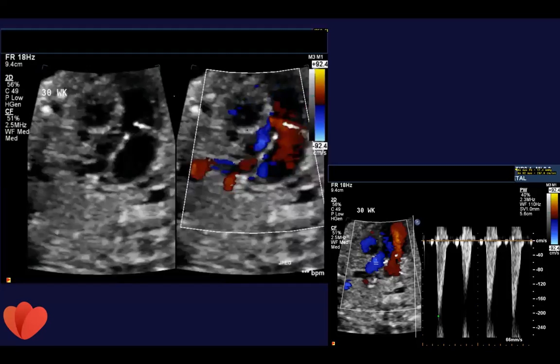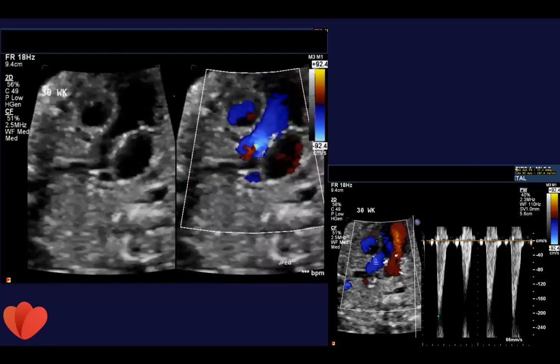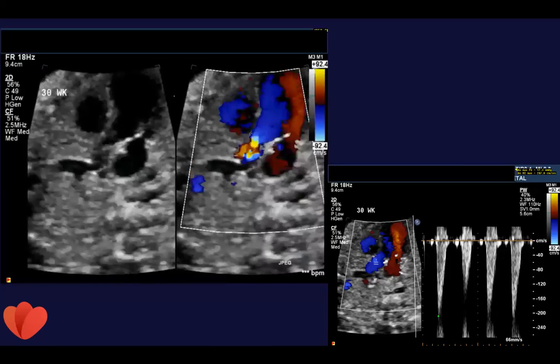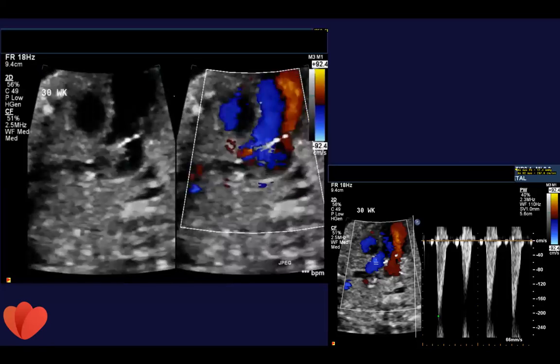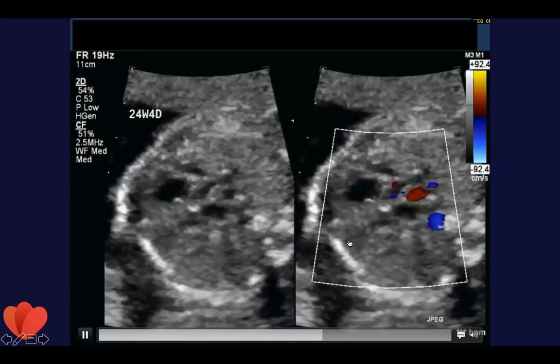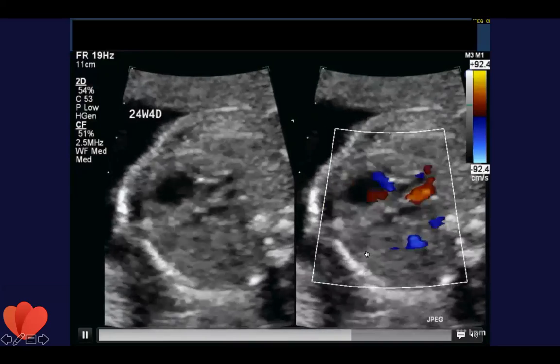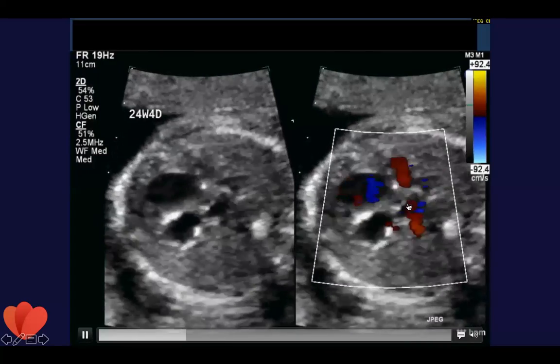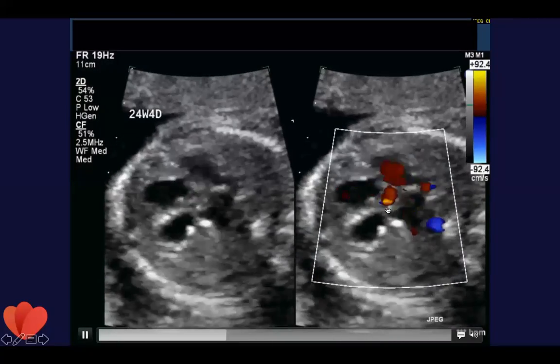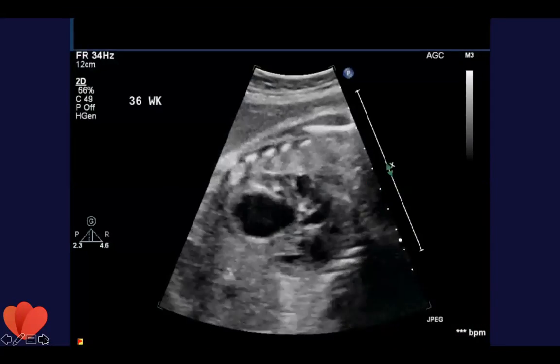And the other scary thing about aortic valve stenosis is that it can be rapidly progressive. Even as a newborn infant, it can progress within a few weeks. So we always have to keep an eye on it. This is a more mild form of aortic stenosis compared to this patient. As you can see here, you've already looked at the LV. You can see that the LV is very echogenic, has EFE, and is very dysfunctional. And when you look at the inflow through the aortic valve, it's very small. When you put a Doppler through it, the velocity is very high.